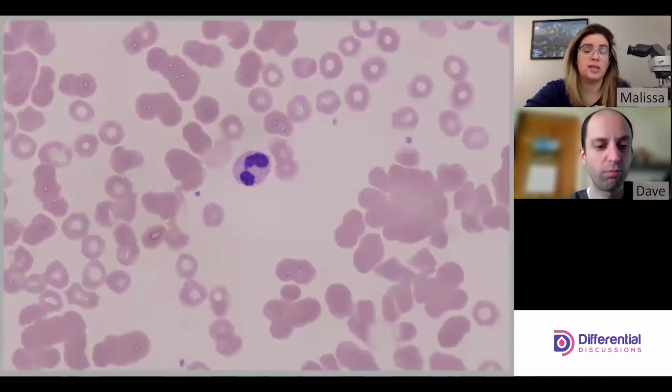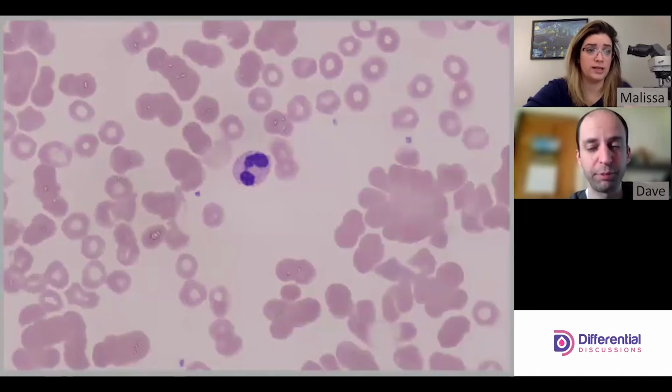A lot of times it depends on how severely agglutinated they are, if you'll notice it before it goes on the analyzer or not. But there's several different ways you can deal with this. Probably the most common would be just to warm the specimen and rerun it. So it depends on your institution, what you're going to be doing. Like I said, there's several different ways, but that's how it'll affect the CBC.